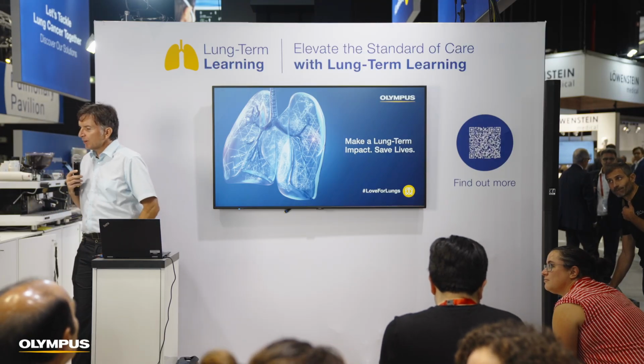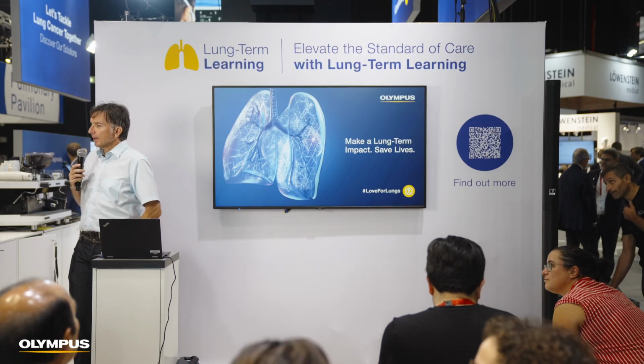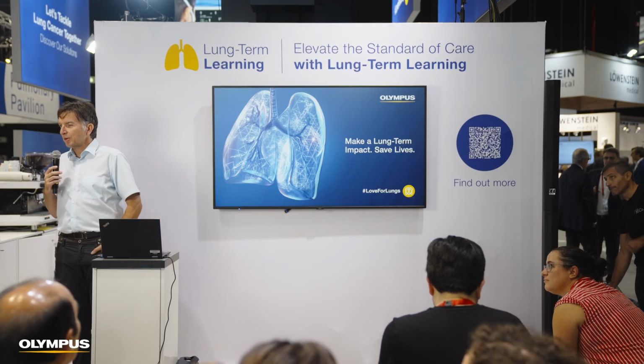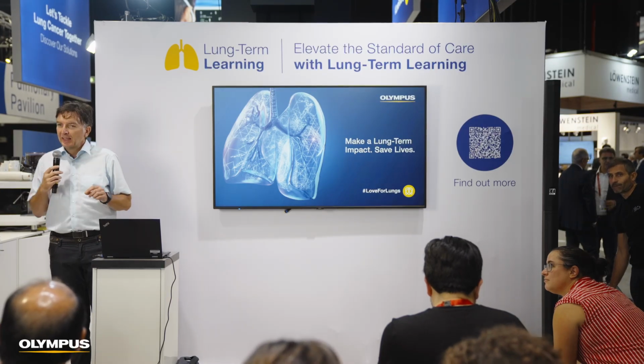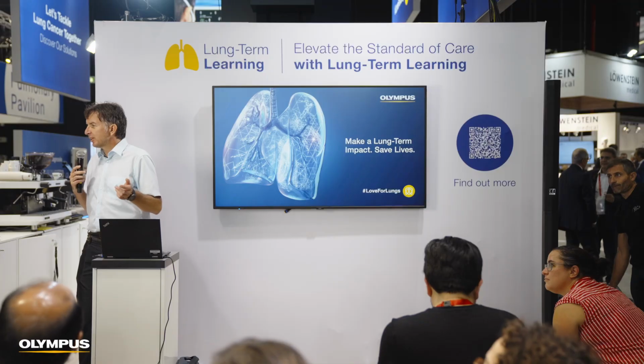I would use it. Actually, I use it quite often. It looks like this: you select your target, you make the first puncture with the EBUS, and then the nurse needs some 20-30 seconds to put out the sample, reprocess the needle, and you are waiting for the next puncture. This is the time when you can play with elastography, look at the colors, select the better target. So it doesn't necessarily prolong the procedure, but while the nurse is reprocessing the needle, you have an opportunity to check this area either elastographically or with Doppler mode.